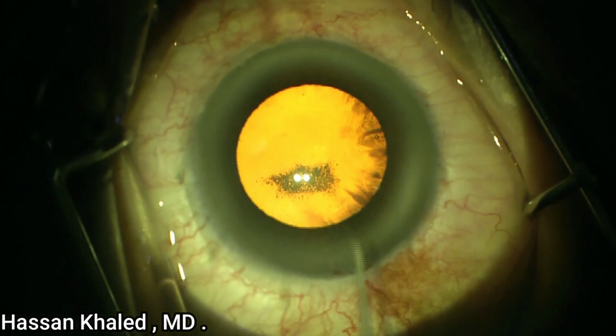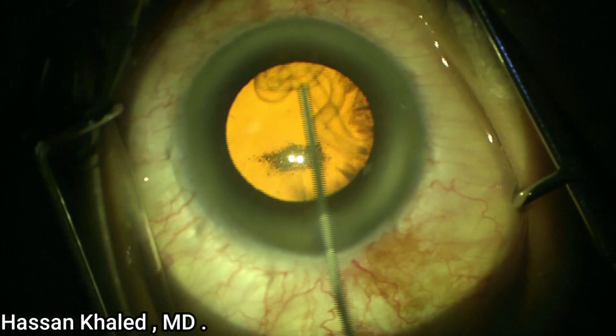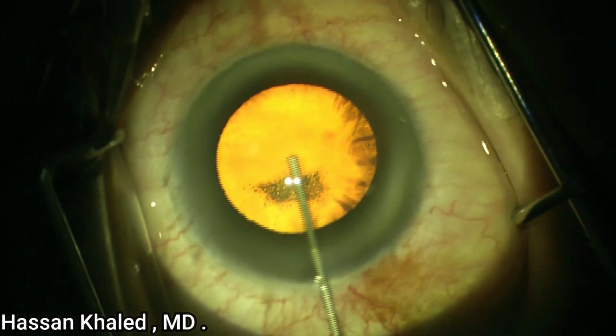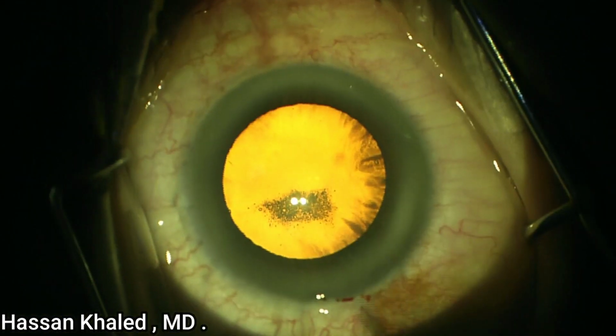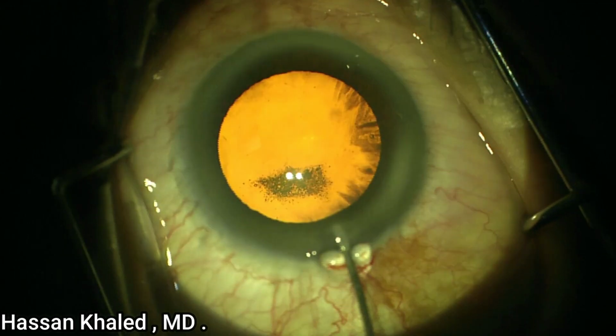You can see it is a two-step incision, then injecting dispersive OVD to coat the endothelium of the cornea to protect the cornea during the phacoemulsification.